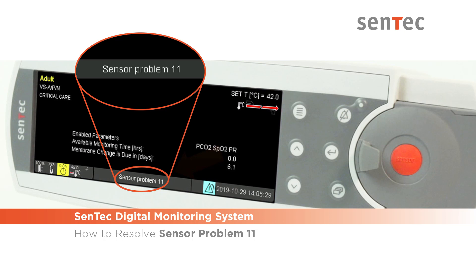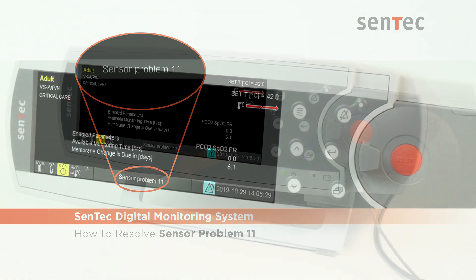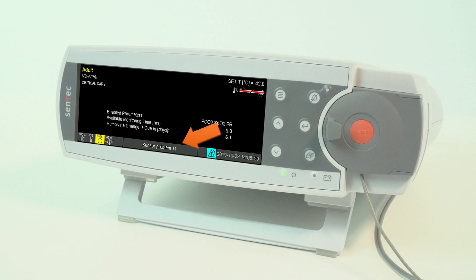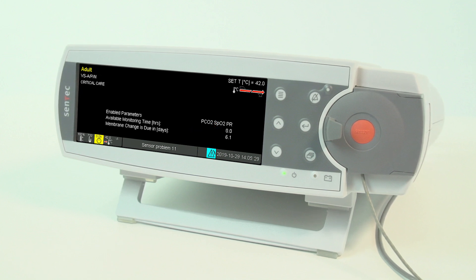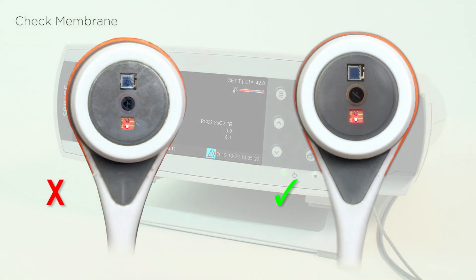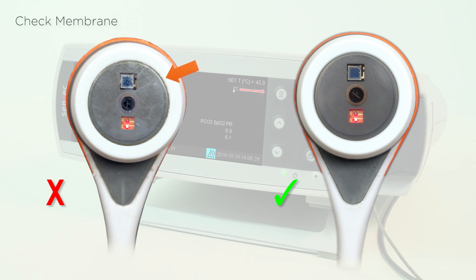This video will explain how to resolve a Sensor Problem 11 error message displayed in the status bar of the monitor. This error message is commonly caused by a defective membrane or dried electrolyte, as shown on the left.